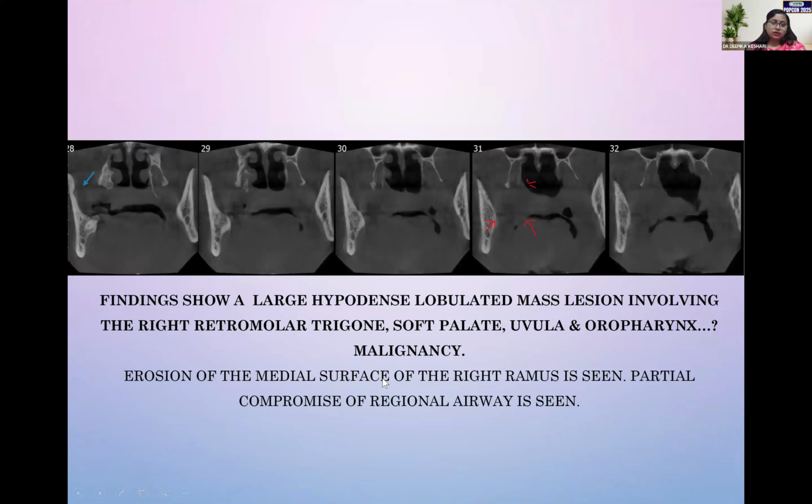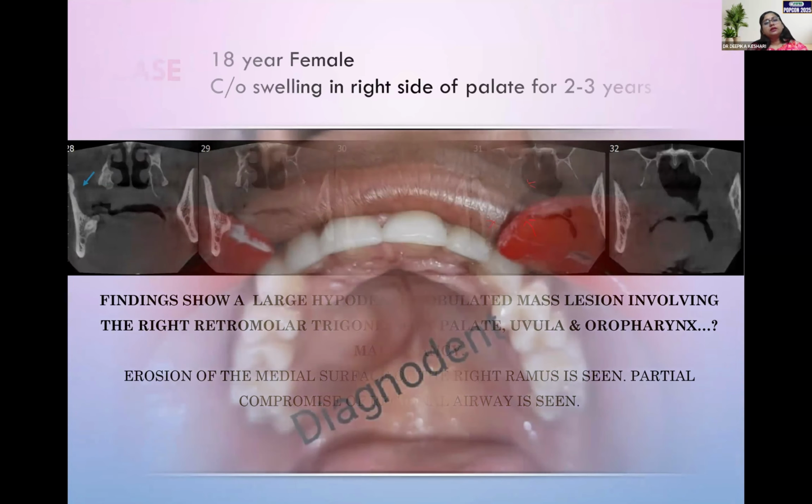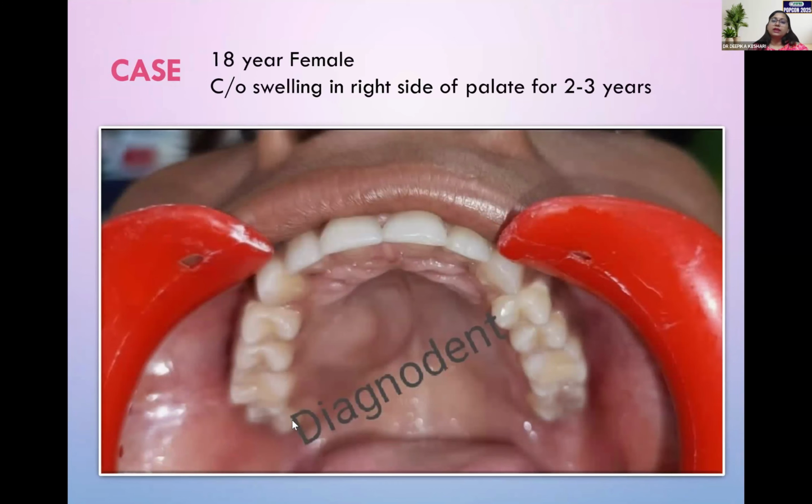So it was considered to be a soft tissue mass, most likely to be a malignancy. So the patient was referred for further management. Now, this 18-year-old female patient complains of swelling in the right side of the palate for 2 to 3 years.